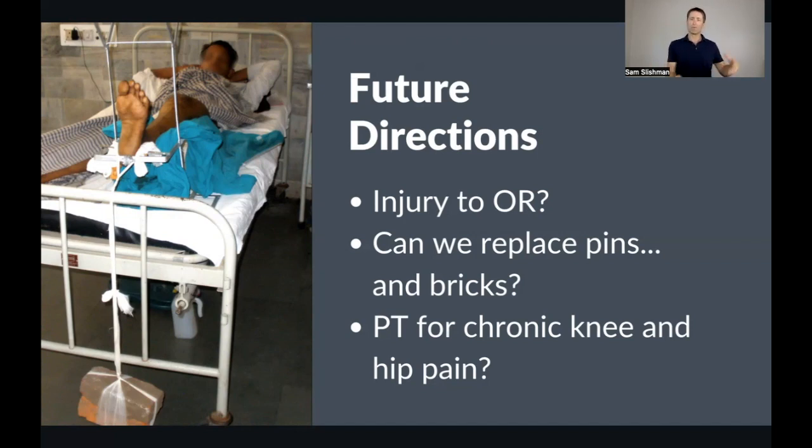But other people will remove traction splints and they'll put on orthoglass, or they'll do other things. And so every transition is painful. I would like traction splints to be applied in the field, left on through the emergency department, left on through the CT scanner, left on all the way to the operating room. And even if the OR is going to be 2 or 3 days from now, I think it's okay to do that rather than assault somebody with a traction pin.